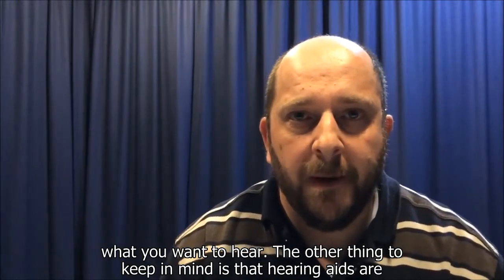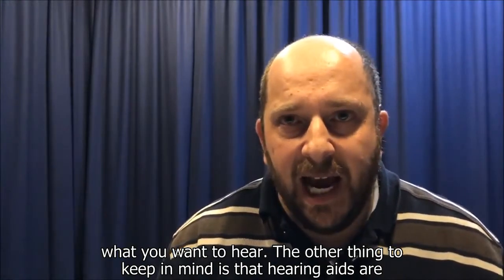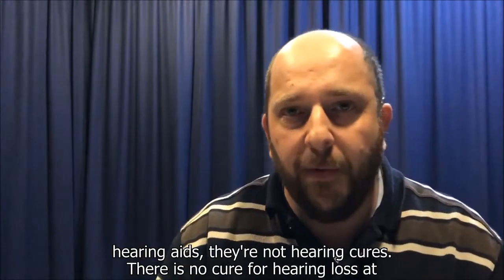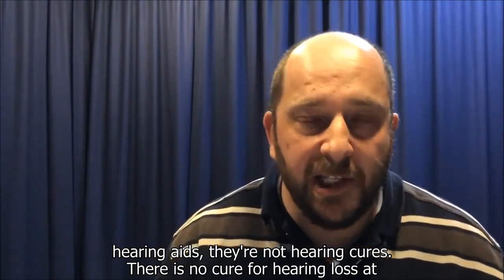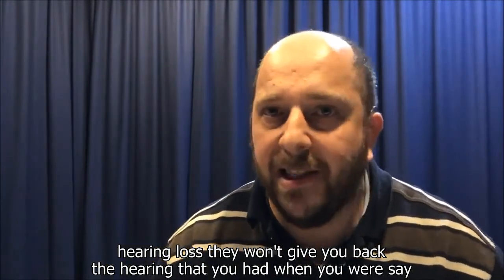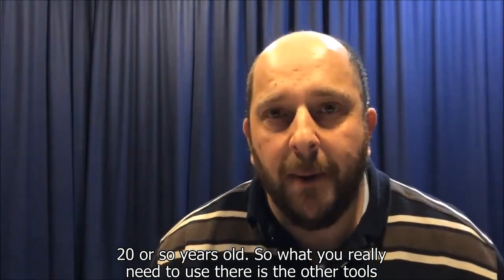and you can then focus on hearing what you want to hear. The other thing to keep in mind is that hearing aids are just that. The name in itself implies exactly what they are. They are hearing aids. They're not hearing cures. There is no cure for hearing loss at this point. Hearing aids certainly do not cure hearing loss. They won't give you back the hearing that you had when you were, say, 20 or so years old.